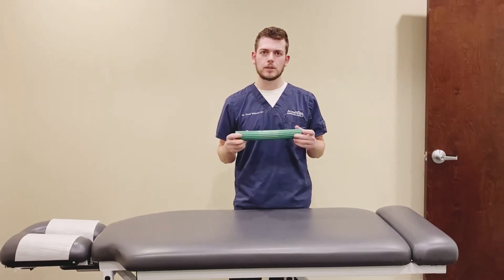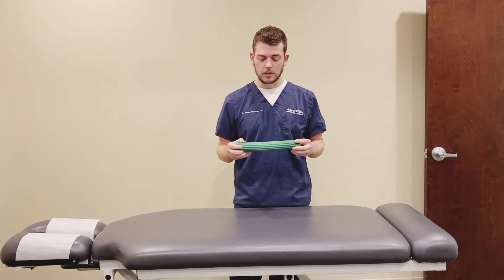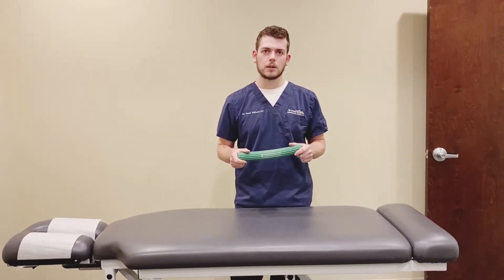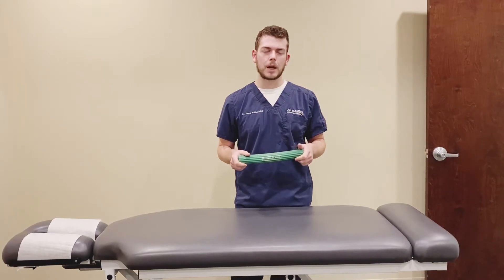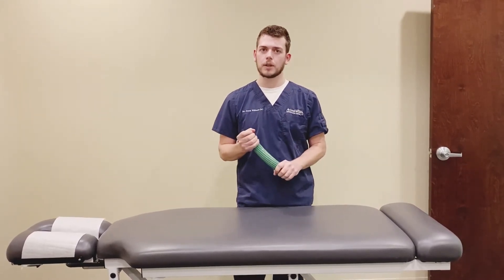The TheraBand Flex Bar — I'll put a link on where you can find this. These are awesome for a ton of different exercises. You really can't find anything to mimic it very well, so I usually recommend people just buy one because it's something that you can continue to use, especially if you're an athlete.